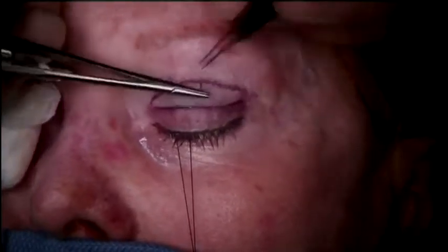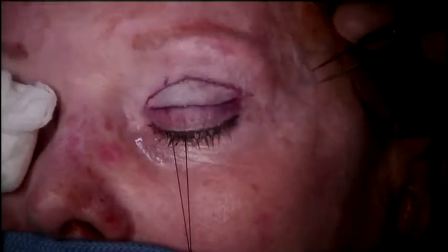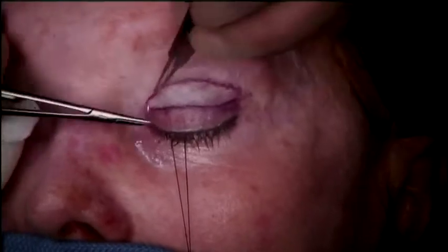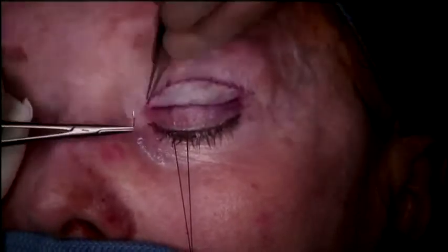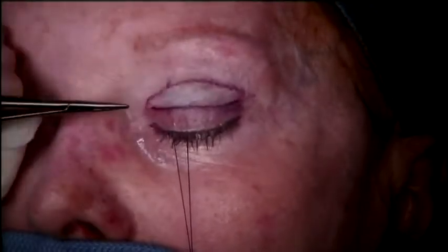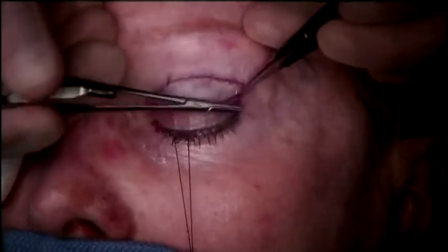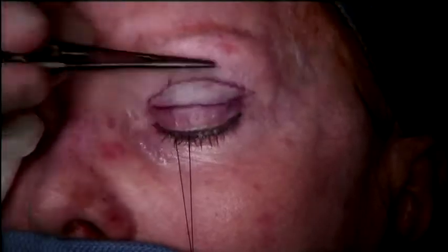A couple of things to mention here. Typically on a post-operative case like this, I go ahead and patch the patient. I do a pressure patch over the skin graft, and that helps things to heal well. We put a little bit of Maxitrol or erythromycin, any antibacterial ointment over it, and patch it for 1 week. And when the patient comes back, the skin graft is healed and it's in. You're not worried about any kind of movement on that end.